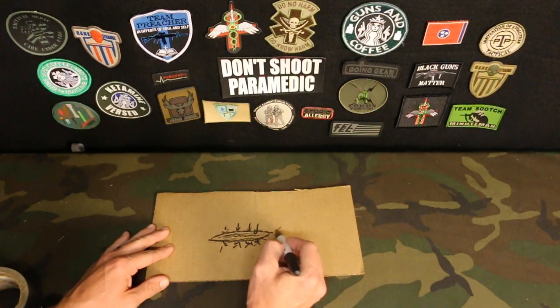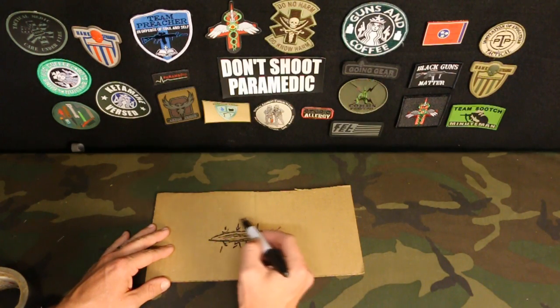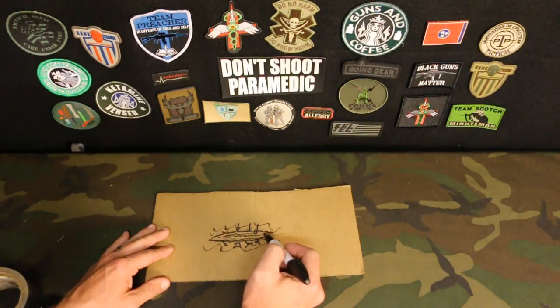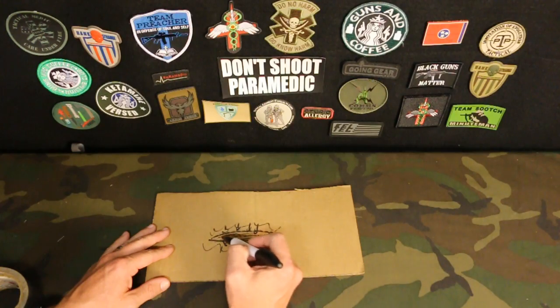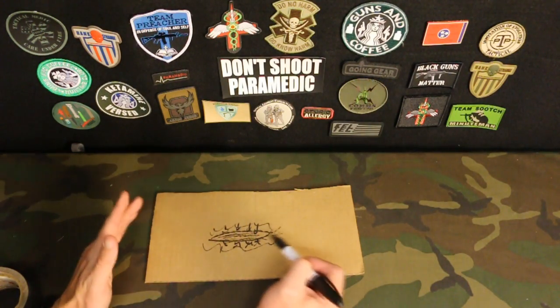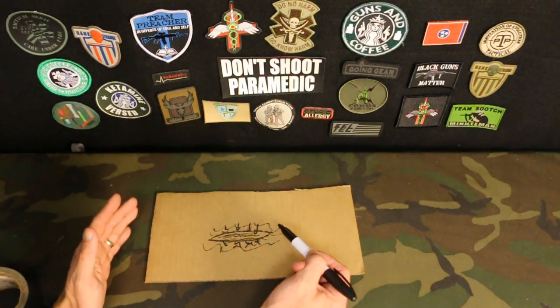So that's why we flush with saline. You can flush this out. You can use like betadine ointment around it. We really have gotten away from peroxide because it takes away the good germs too. But you want to try to close this up, which is why we use the butterfly. So I'm going to show you how to do butterflies and then how to make your own with the duct tape. Whenever I start talking about butterfly bandages, someone's always going to bring up sutures.